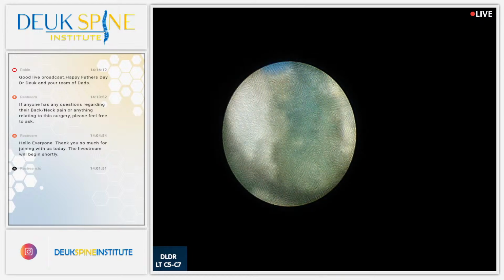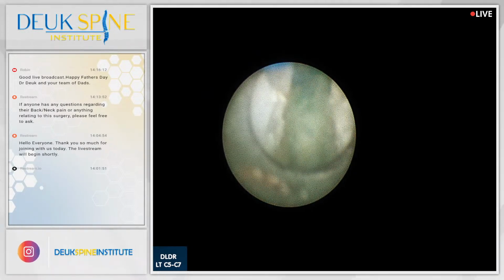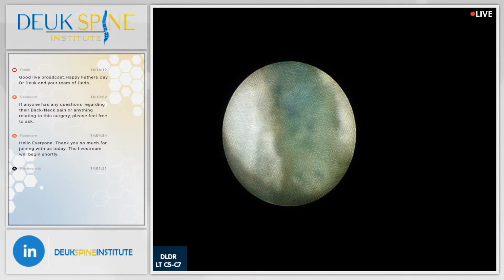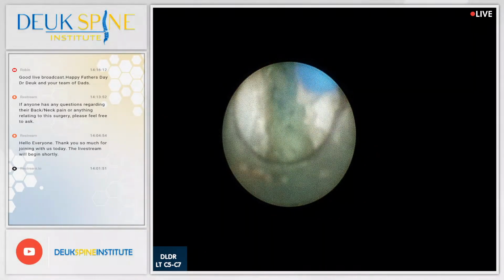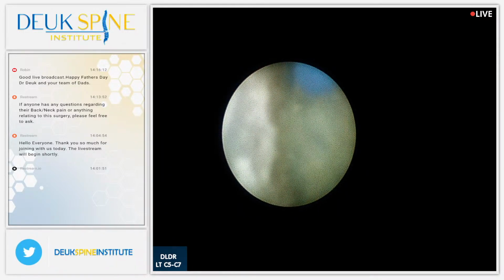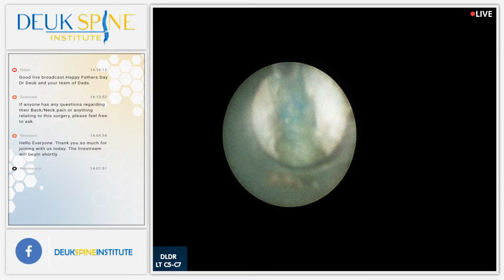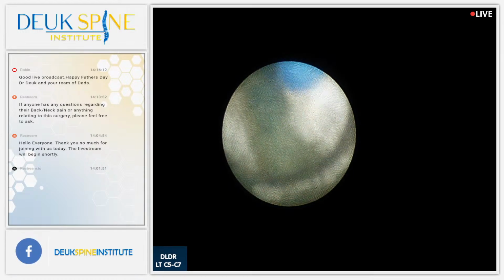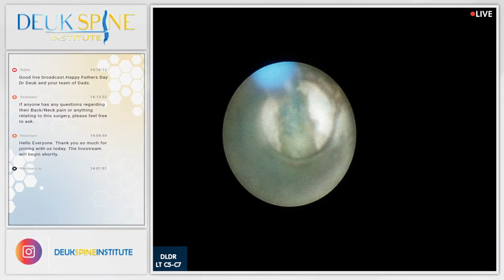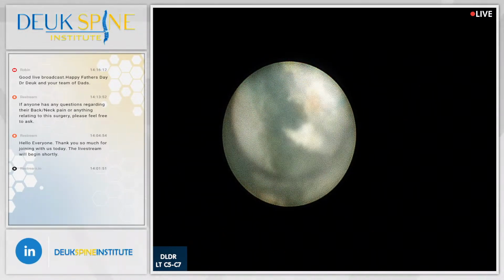All right, welcome back. That was a quick video. A lot quicker with the new ones, huh? Yes, indeed. So you guys can see the movement. If you look carefully, you can see the bones moving back there. That's what we want. We want to preserve movement. Our surgery does not take that movement away. If you do a fusion, on the other hand, patients lose that movement. And we don't want to take people's movement away at a disc, because if you lose movement at one disc, it puts a lot of stress on the other disc. And then the other discs wear out and you get what's called adjacent segment disease.